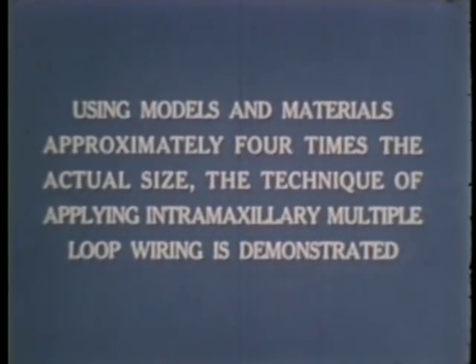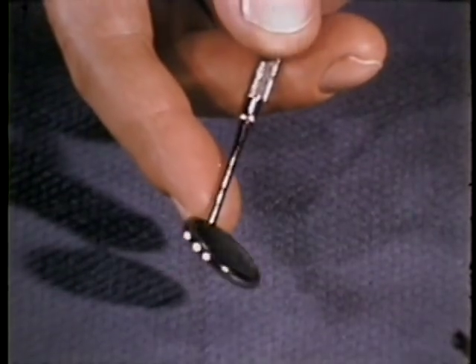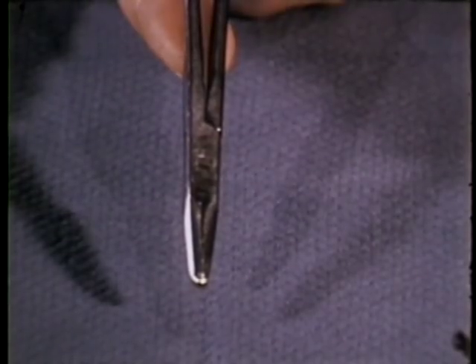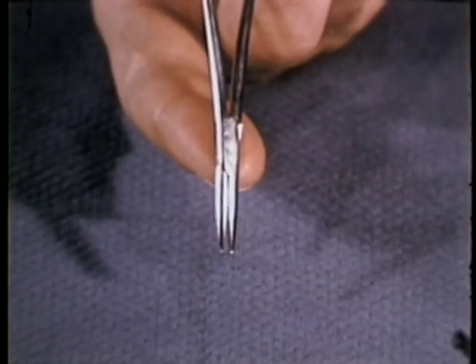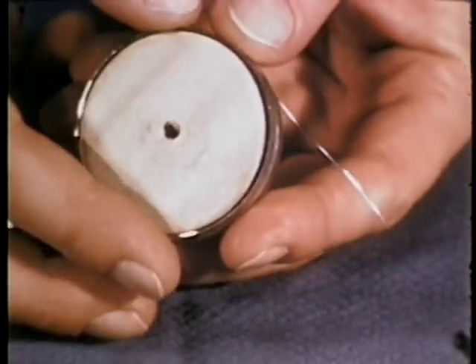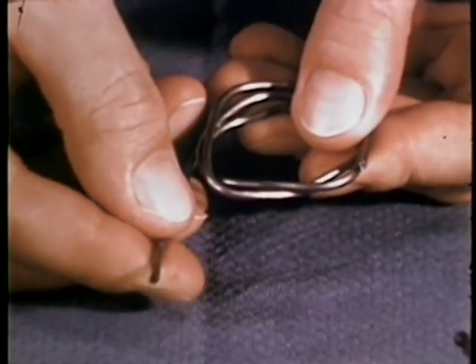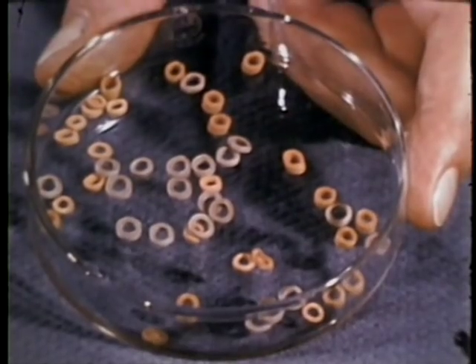Using models and materials approximately four times the actual size, the technique of applying intramaxillary multiple loop wiring is demonstrated. Minimum instrument requirements include a mouth mirror, a number one Woodson plastic instrument, two seven-inch Hegger needle holders, one mosquito hemostat, and one number 150 wire cutter. The materials required include 0.016 inch stainless steel wire, medium-sized rosin core solder about 10 to 12 gauge, and elastic bands.